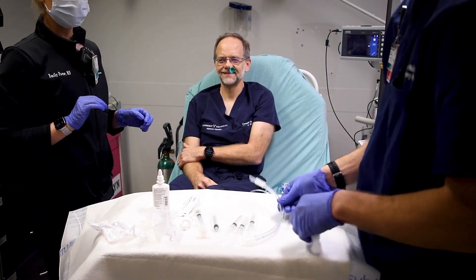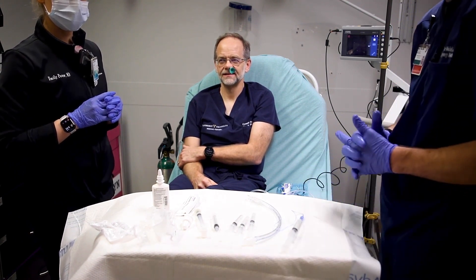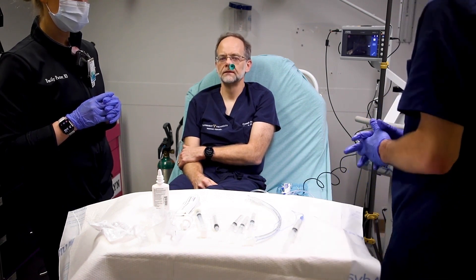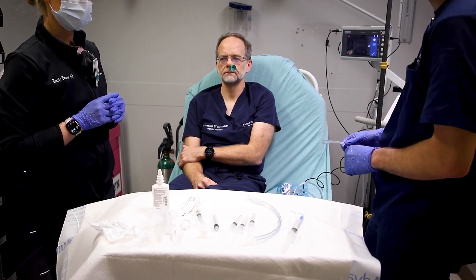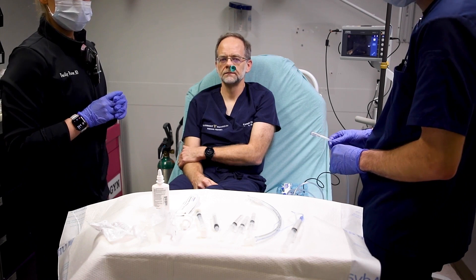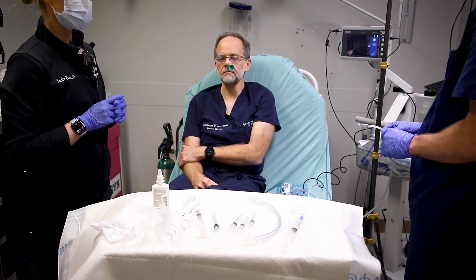Here we have a 7-0 ET tube. For females, you'll typically go with a 6-5 or 7-0 ET tube if you're going through the nose. For males, a 7-0 to 7-5. This has been warmed up in warm water to make the tube more flexible and reduce the incidence of epistaxis when placing the tube.